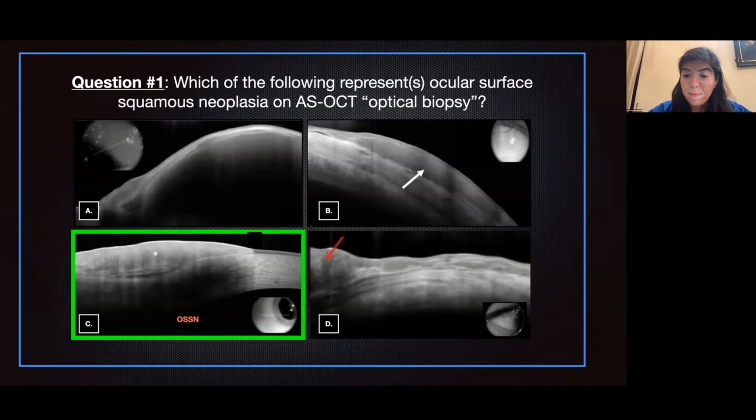So Dr. Nariani, we have some responses in the Q&A. If you want to open that up, you can. Oh, perfect. Would you be able to read that for me, Lawrence? Because I'm not able to open it up on my screen. Sure. So we have, someone said A would be melanoma, B is lymphoma, B could be pterygium, D amyloidosis. Super. Well, we have a brilliant audience out there.